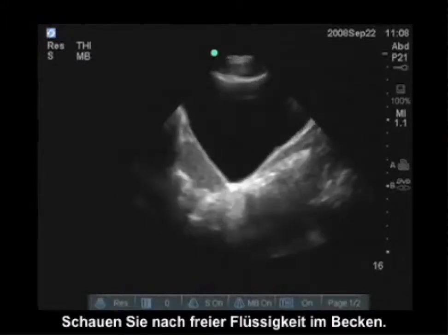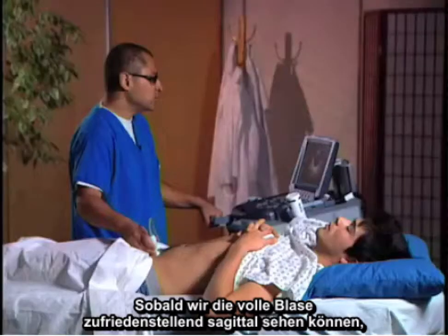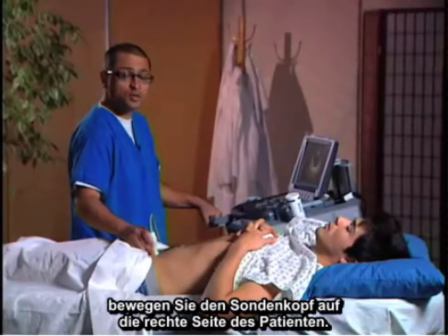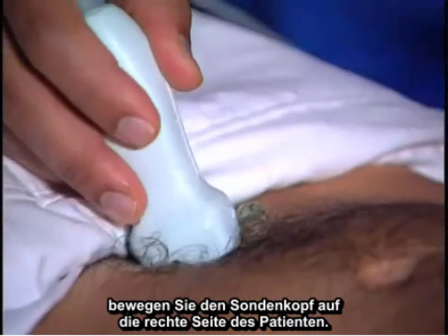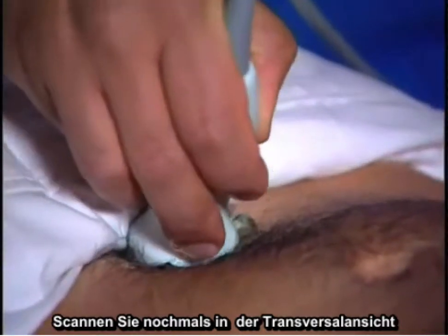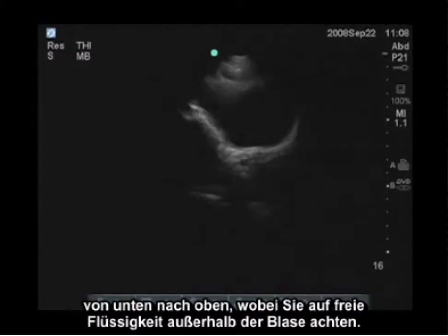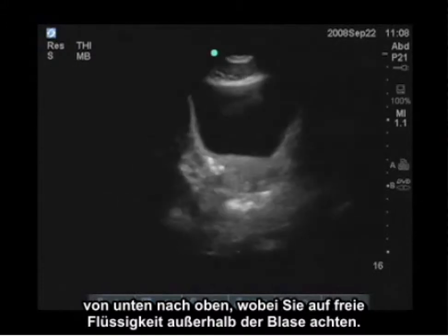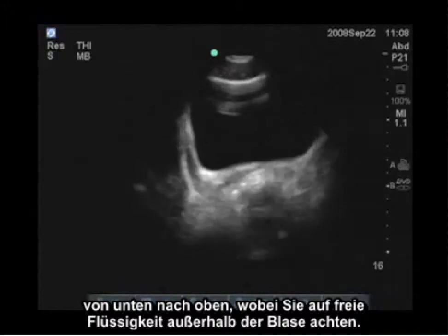So we're looking for free fluid within the pelvis. Once we're satisfied that we can see the full bladder in a sagittal fashion, we're then going to turn the transducer marker toward the patient's right, and we're going to scan again — now we're in a transverse view. We're scanning from very inferiorly to superiorly, again looking for free fluid outside of the bladder.